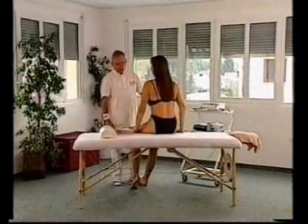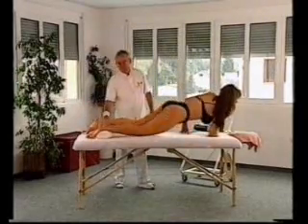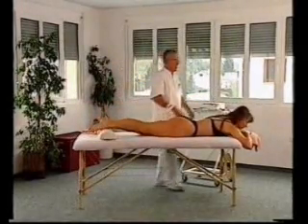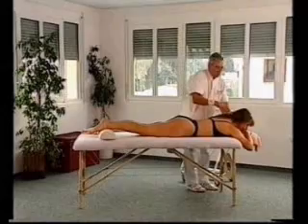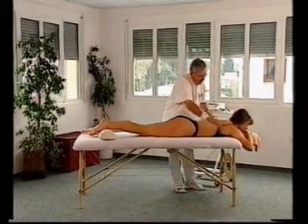Deep oscillation with the Hivamat 200 is an entirely new therapeutic procedure. Deep oscillation is intended to supplement and intensify techniques of manual therapy rather than replace existing forms of therapy.